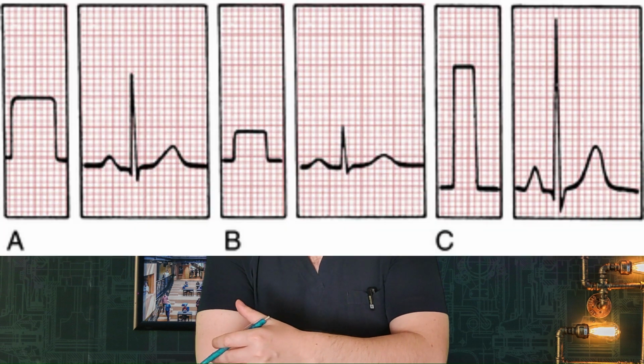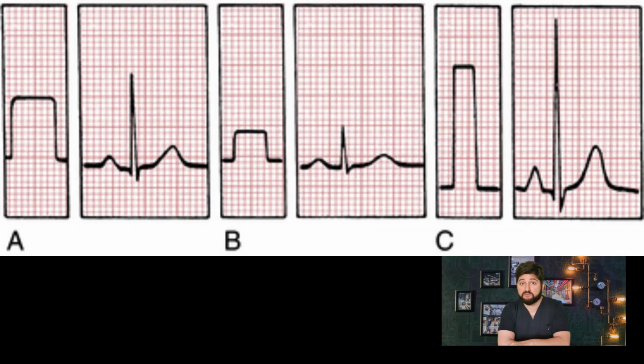So, when it is amplified, we should have a standard voltage, standard calculation. Always it is 1 millivolt or 10 small squares or 2 big squares. It should always be like this. Let me show you an example. Here we see 3 different types of ECGs, and they look different, but in reality they are the same ECG at the same time from the same person.